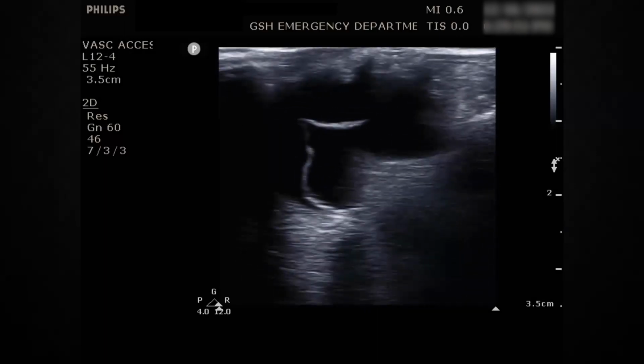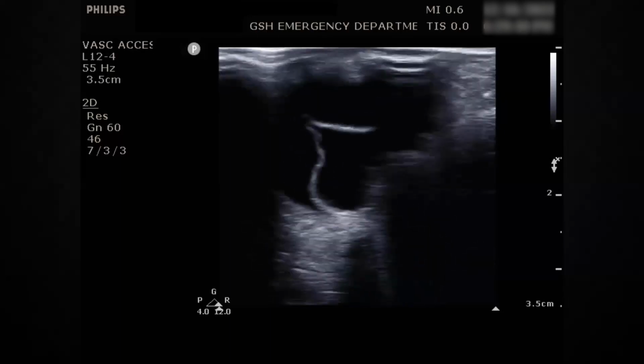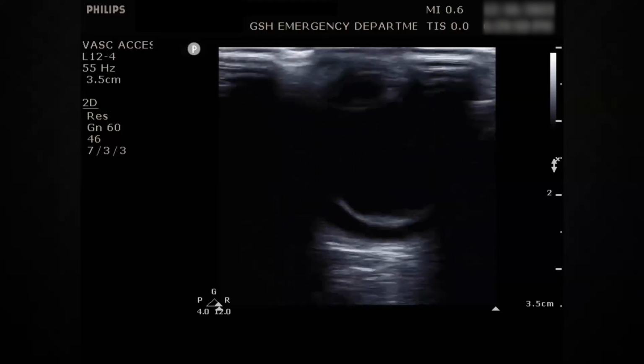Now, in this particular patient, you couldn't get a good exam. He's also drunk, so he might not cooperate for visual acuities very well. So you might not even know that he has a vision change, and this might have gone missed otherwise. So you speak with ophthalmology and they're like, yeah, we'll come manage this right away. And you changed the management in this patient by doing this ultrasound, which is great.